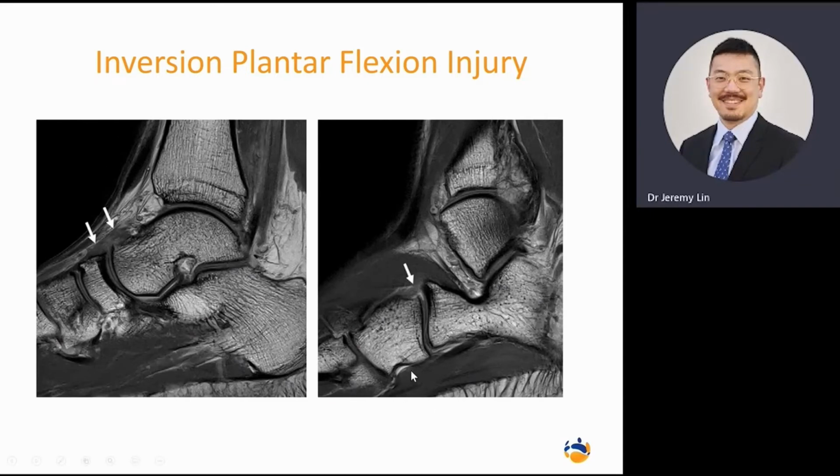This is MRI examples of those two same ligaments we were talking about. This is the dorsotalonavicular ligament. Again, you can see that it is expanded, edematous with loss of normal fibrillar pattern. And over here, this is where the bifurcate ligament is. If you imagine, this is the anterior part of your calcaneus attaching onto the cuboid. It is deep. It is difficult to visualize on ultrasound. And this is why MRI, I believe, is the best modality for imaging if you're suspicious for this kind of injury.